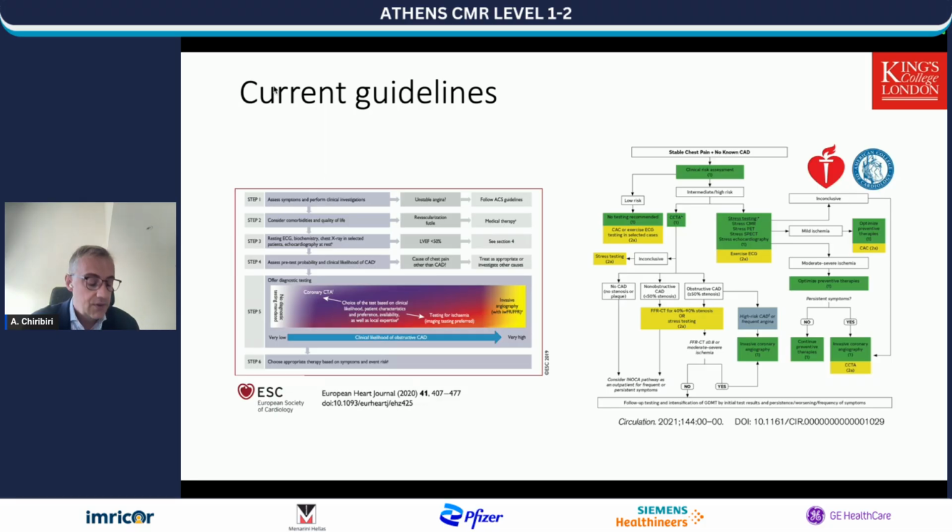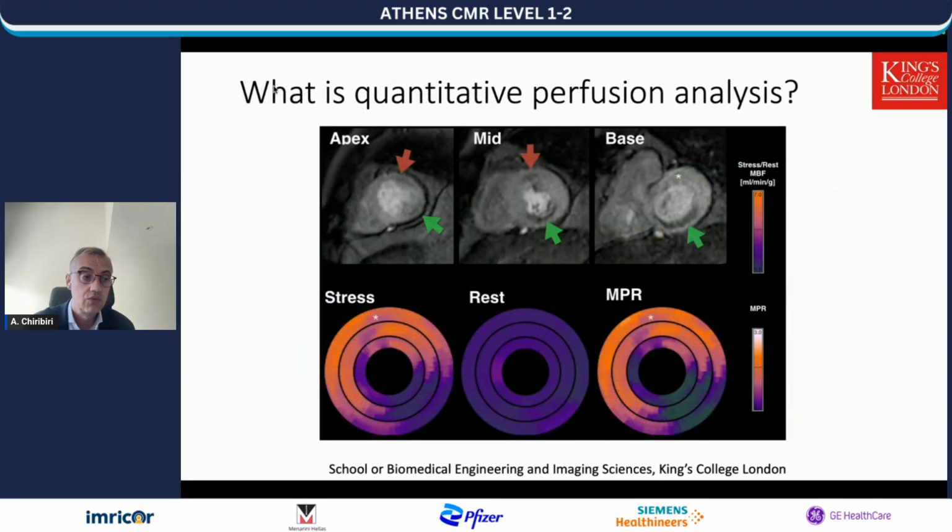and for very good reasons. Now, Professor Mavrogheni, whom I would like to thank for the invitation to present today, has asked me to discuss both visual assessment and quantitative analysis. And therefore, I would like to just show you this picture, which summarizes both methods. So you have on the top your T1 weighted images, first pass perfusion images. These are dynamic scans. I'm showing you the peak enhancement image where perfusion defects are more evident.